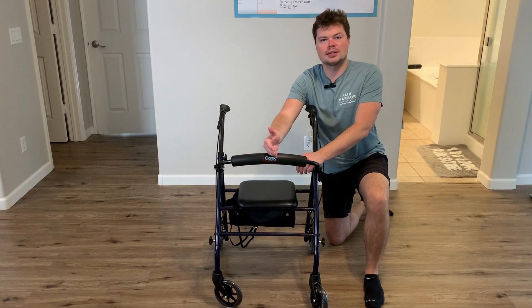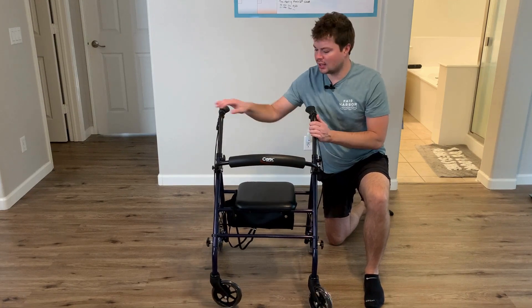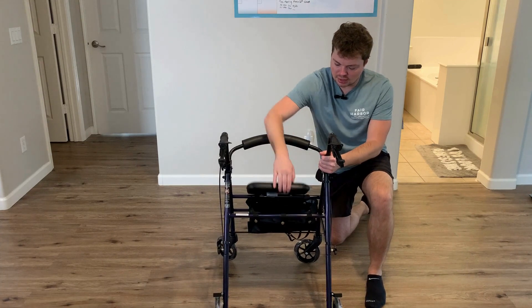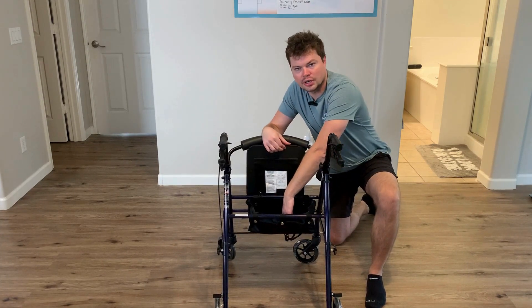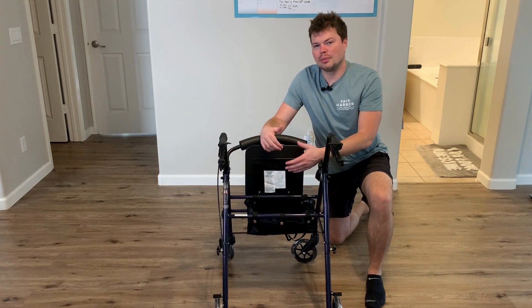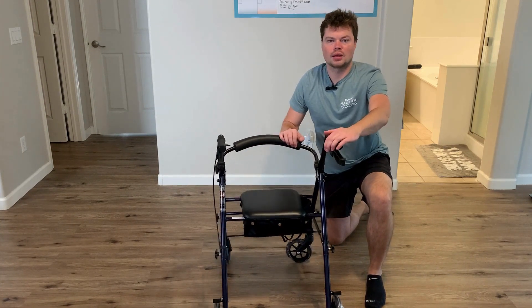Can you attach a basket or some type of storage device to this walker? You definitely could put a basket on the front. They also make it very easy to just lift up the seat and there's a whole storage bag under here for you. The bag is pretty big, so you can fit quite a bit of stuff in there and it's really easily accessible whenever you need to grab it.